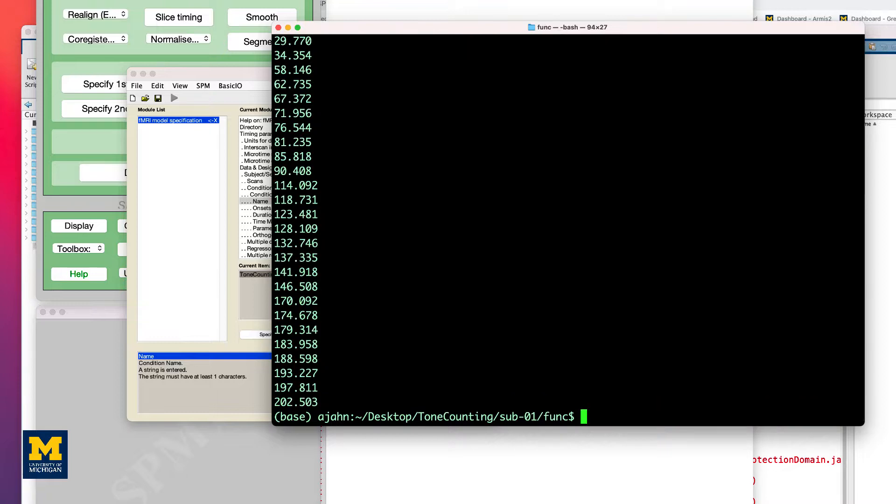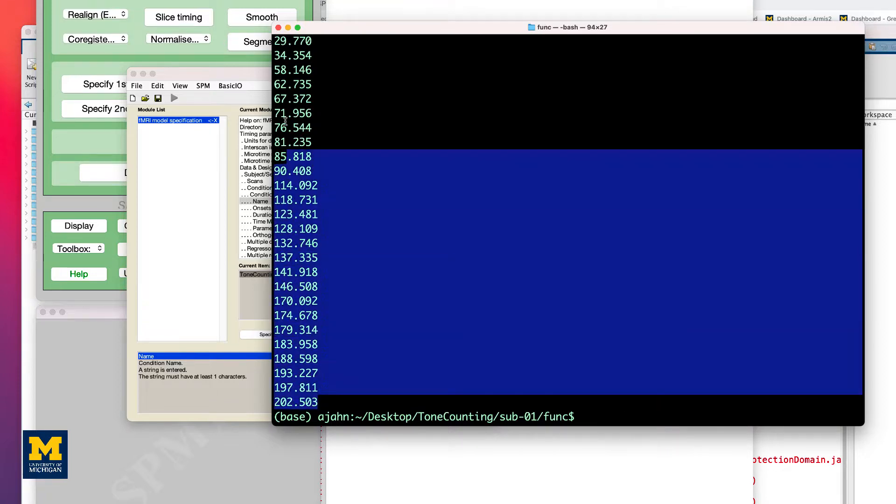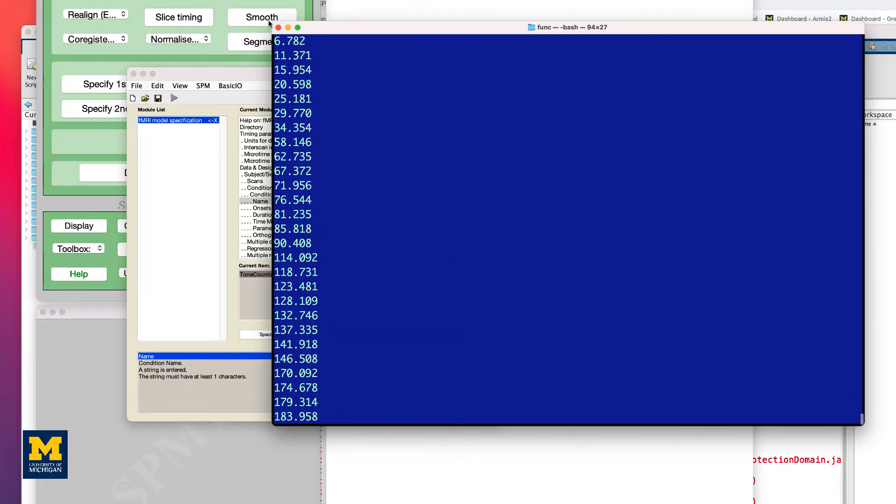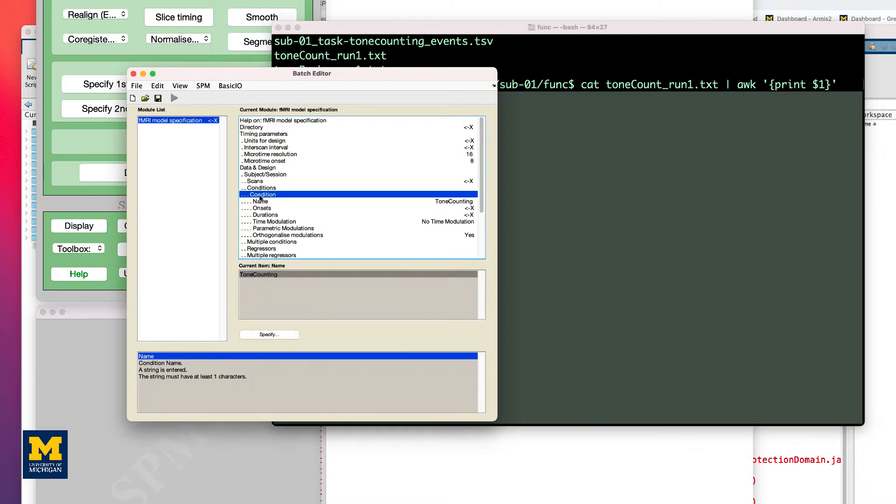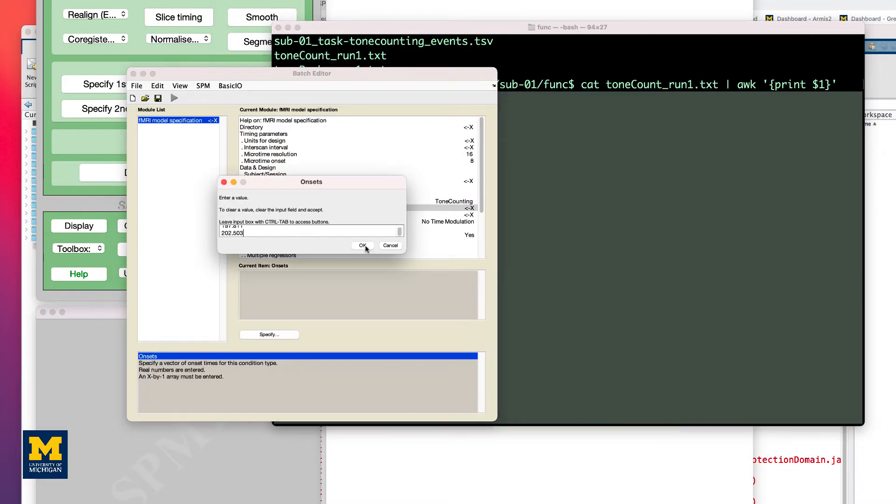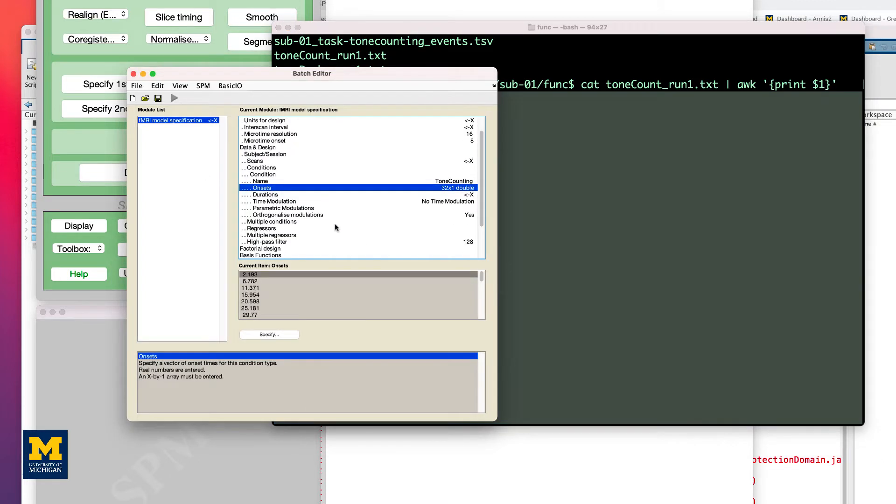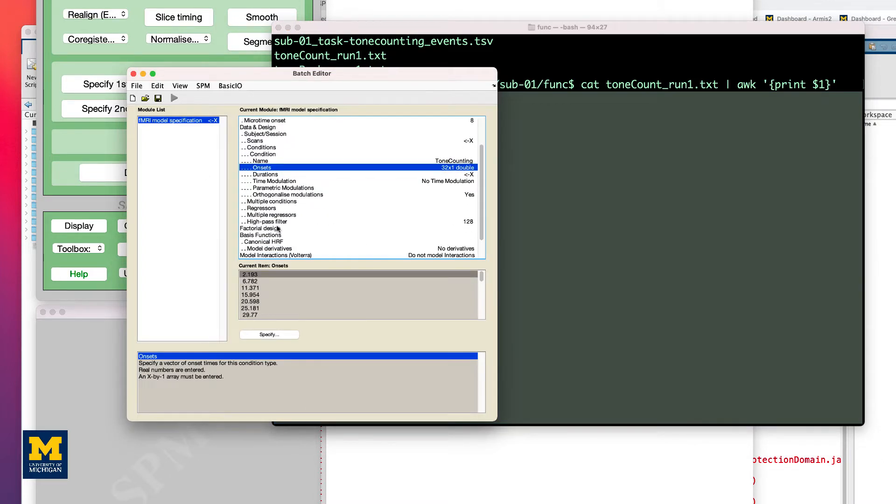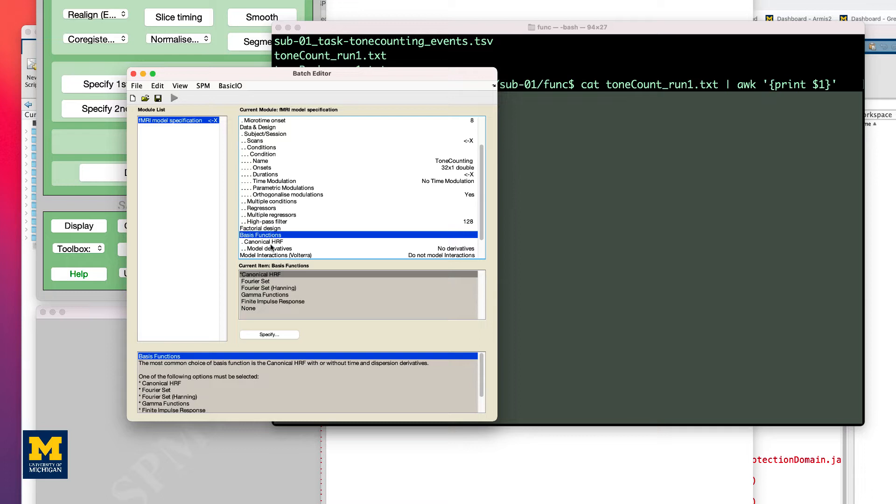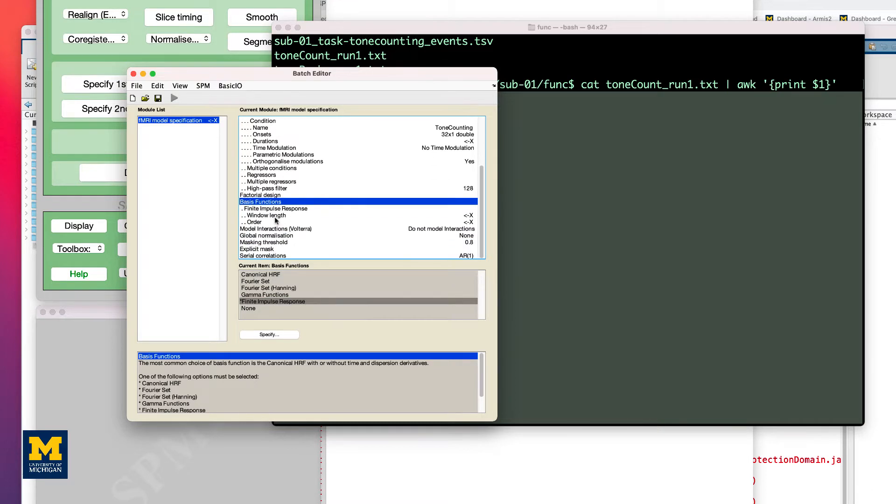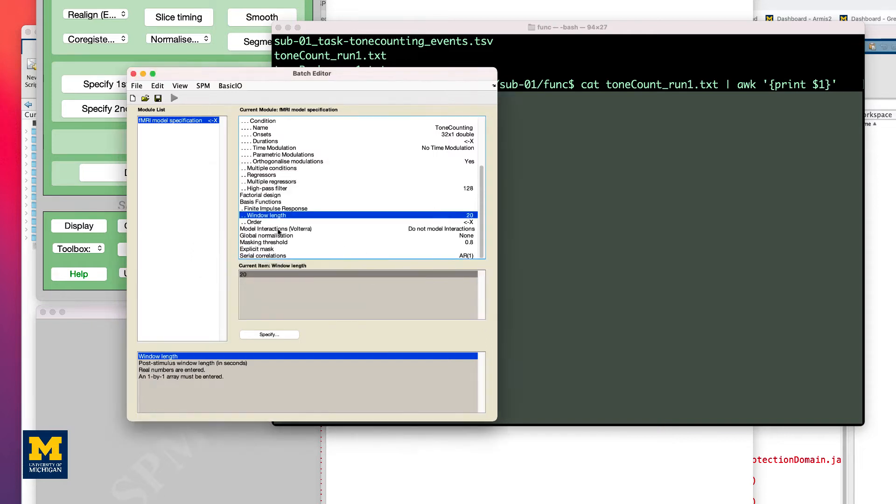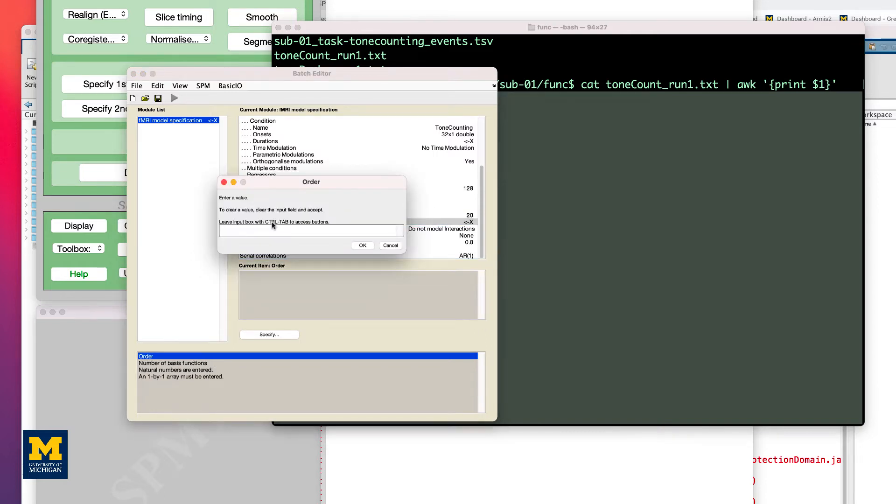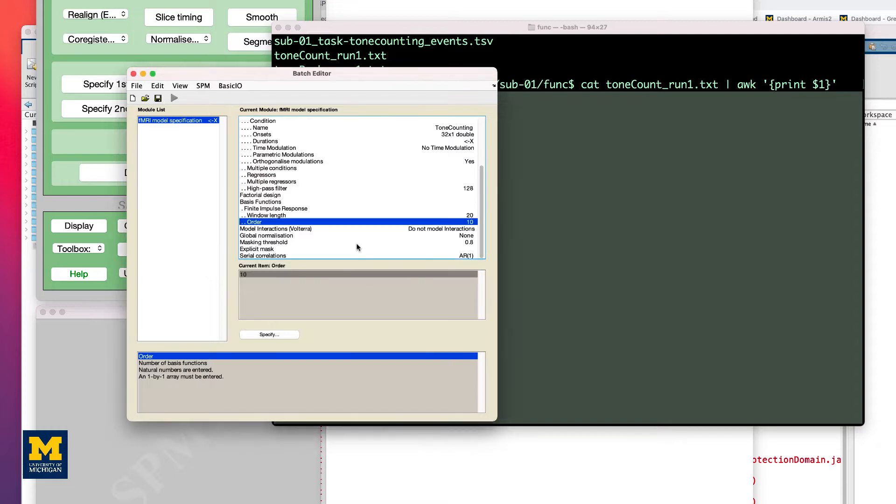Once we print that, copy and paste it just like you would for any other type of fMRI analysis. Now, the main thing we're going to change here is go to Basis Functions and change it from Canonical HRF to Finite Impulse Response and change the window length to 20 and the order to 10. You would then run this by clicking the green Go button if everything else was filled in.